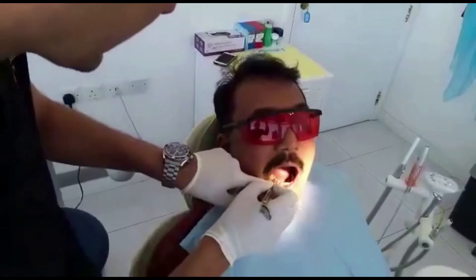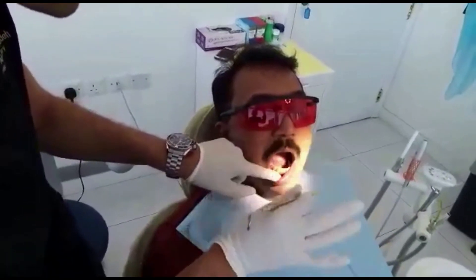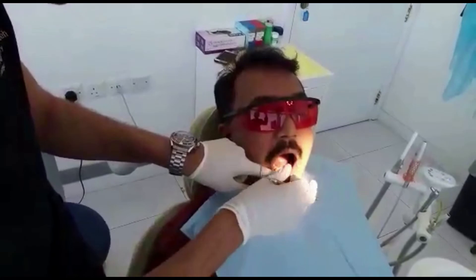I do it every day. And if I give a full carpule and want to do preparation for teeth one through four, I can do it within about 40 minutes.